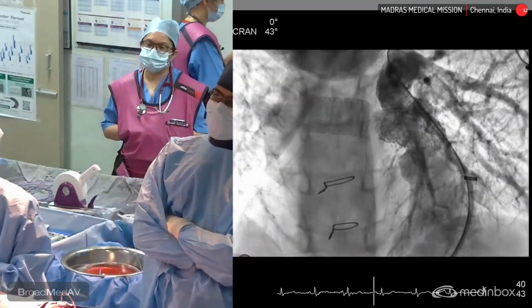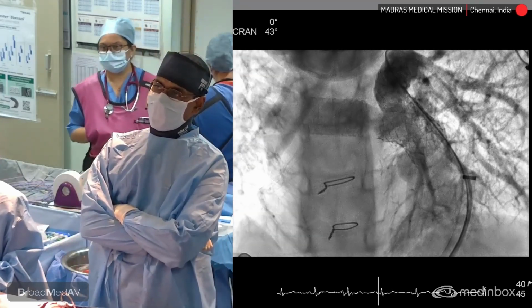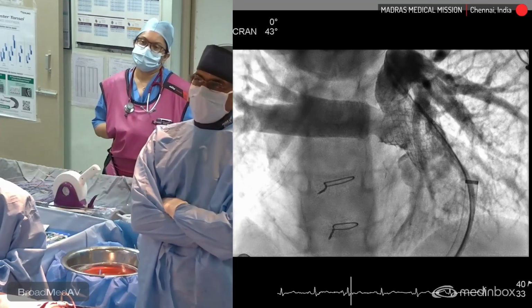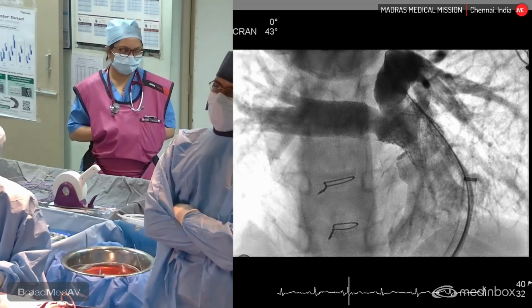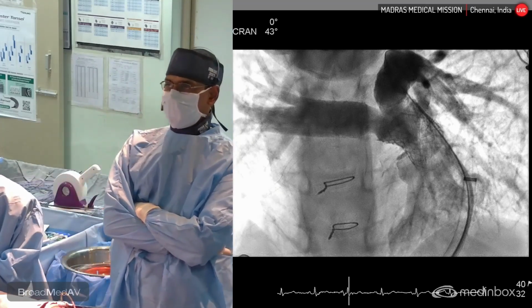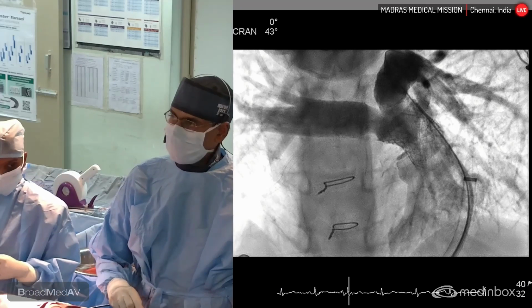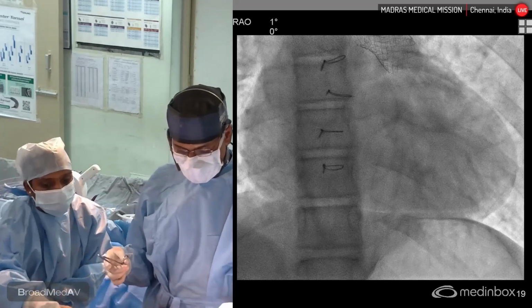the previous. Yeah, so freeze it now. Go back. Yeah, go back further. Correct. So there is a little bit back. Yeah, that's good. So now we are like in the early arterial phase of this pulmonary angiogram. There is a satisfactory increase in the lumen of the entire pulmonary artery. So at this point we are going to come off. Let me take one figure of 8 stitch in the groin.